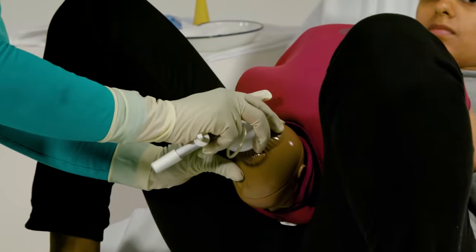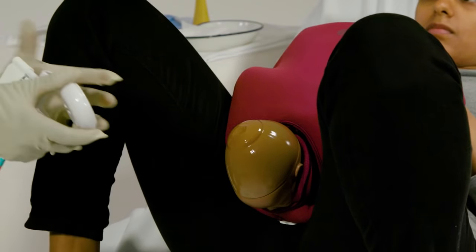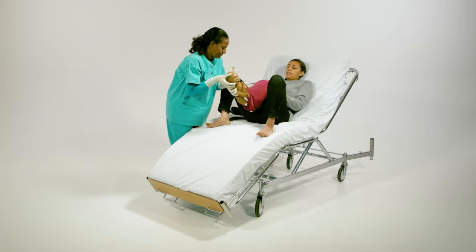When the head is delivered, release the vacuum, take off the suction device, then deliver the rest of the body.